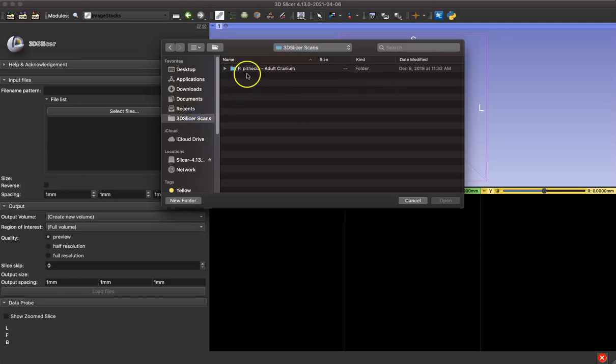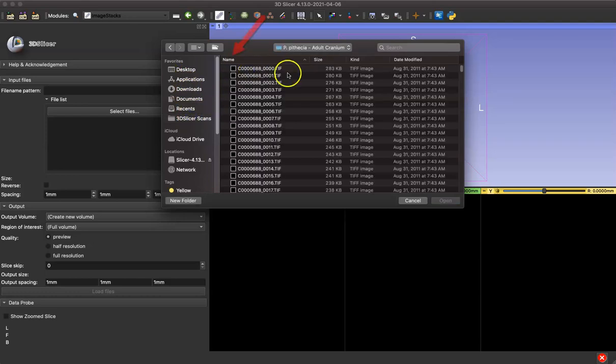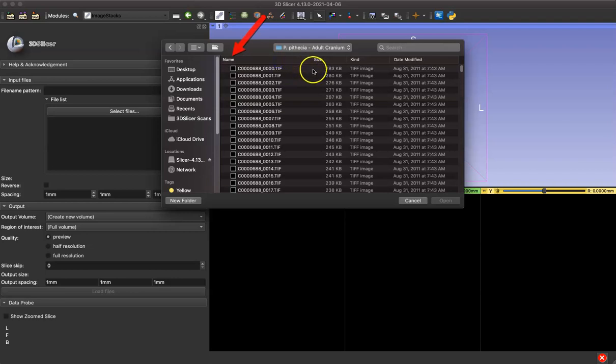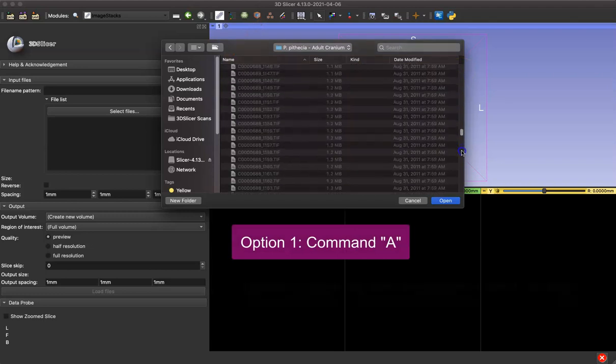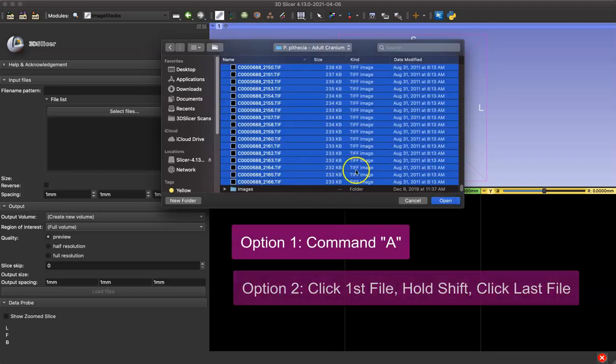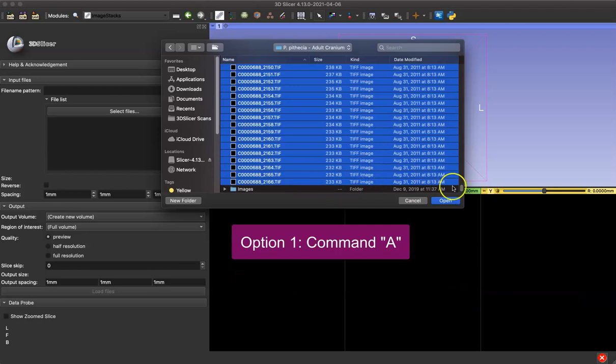It can be helpful to click the Name button to order the images if they're not in numerical order. Then you want to select all your images using Command-A or by clicking the first file, scrolling to the bottom, holding Shift, and clicking the last file. Make sure to only select your TIFF files and not any other documents in that folder.